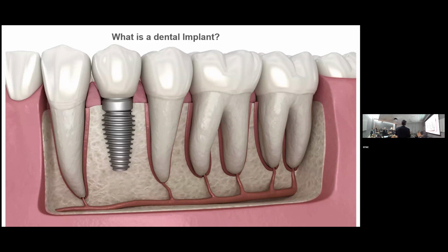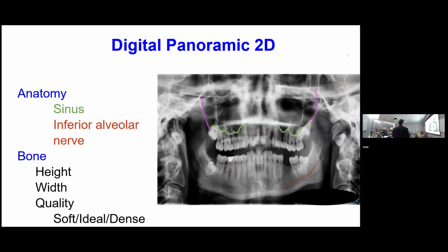So when I first got into this 30 years ago, we were doing our implant placements based on the bone. And then the restorative dentist would have to deal with where we put this implant, because the patient doesn't care about where the implant is. They care about the three-dimensionality of where that tooth is. And so I deal in a very three-dimensional world. Even though I place my implants with CT scans and all that, it's a three-dimensional world I'm in. It has to look good when it's done. Otherwise, people are not happy with us.